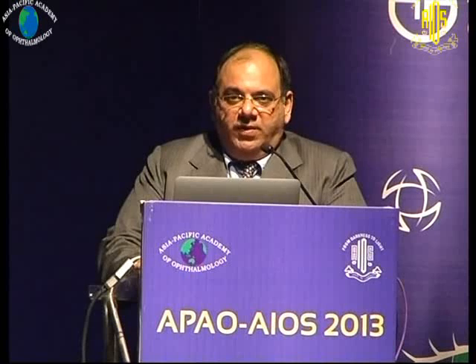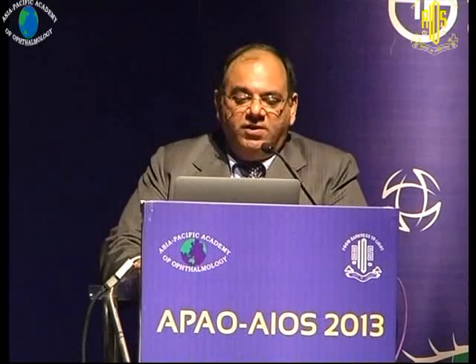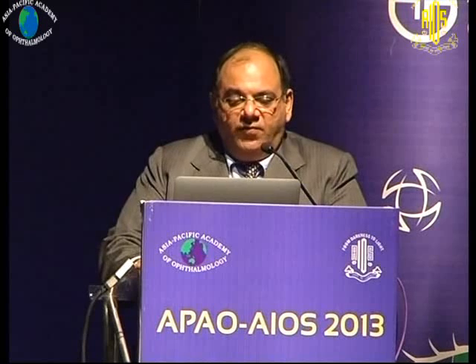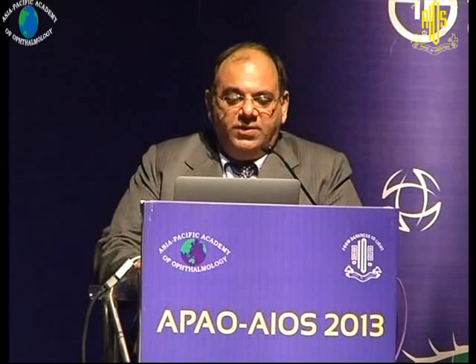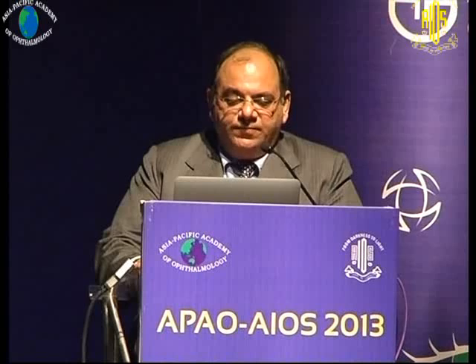When you're looking at trying to do a phaco in a vitrectomized eye, the posterior capsule may also have occult tears from previous vitrectomy, and a cataract developing within weeks of the vitrectomy should raise the suspicion for damage to the posterior capsule during surgery. Capsular plaques are more common, and they are difficult to remove, fibrotic plaques. And finally, the cataracts encountered after vitrectomy tend to be characterized by denser nuclear sclerosis.